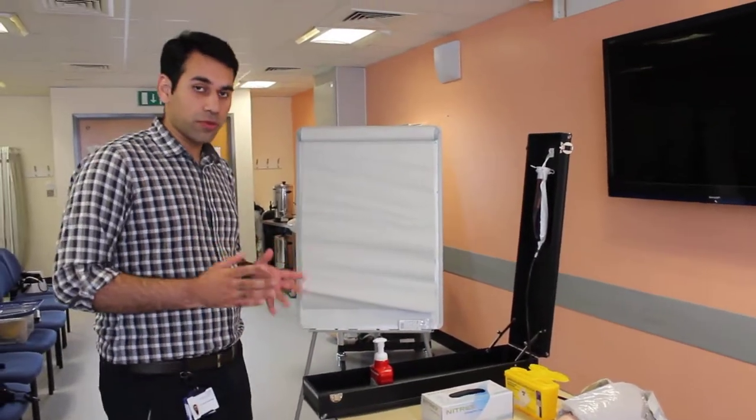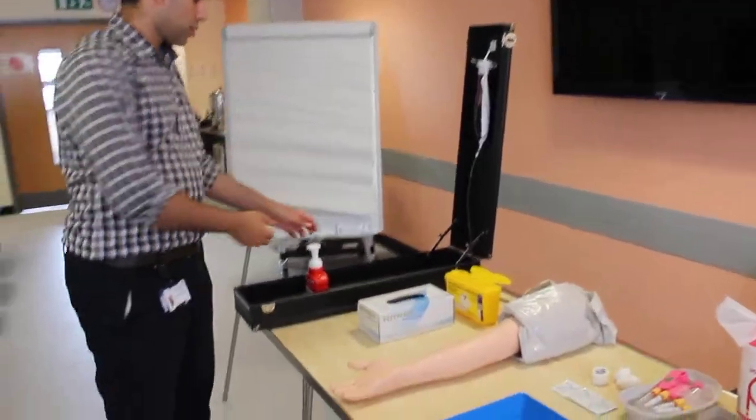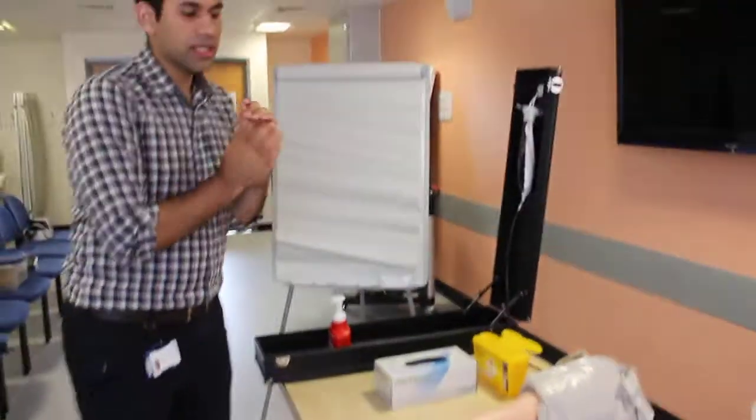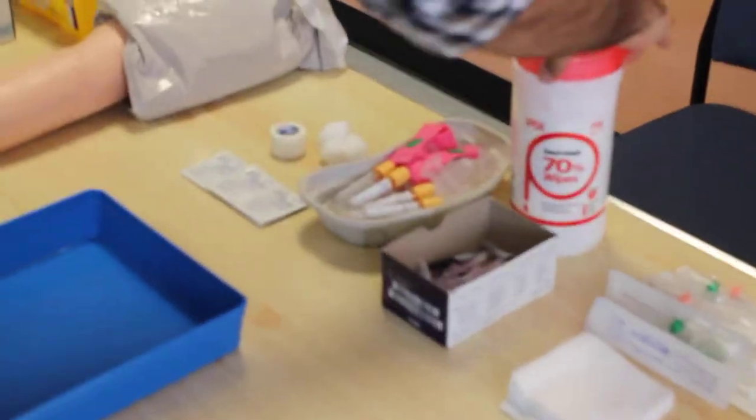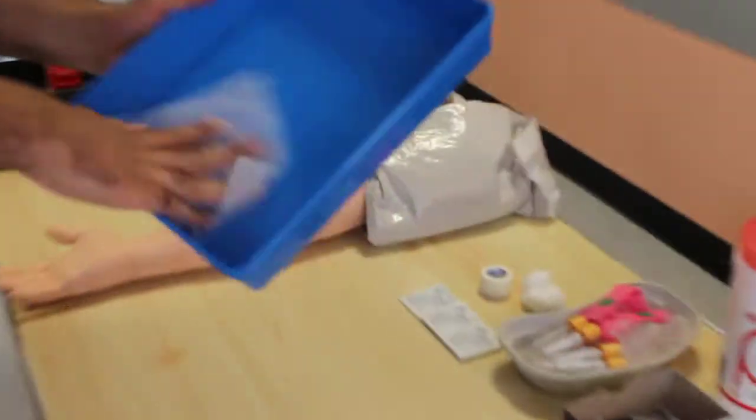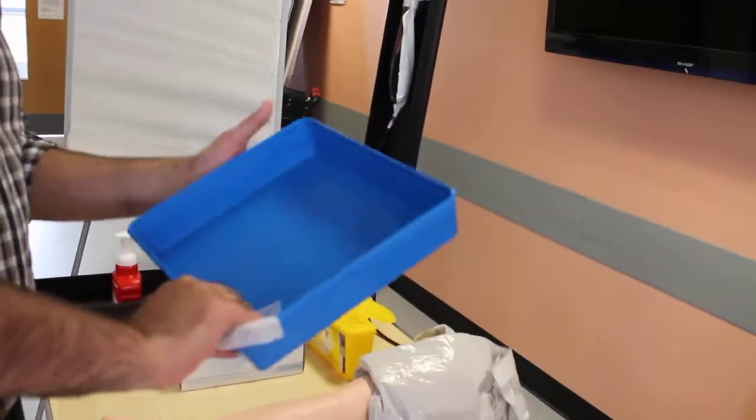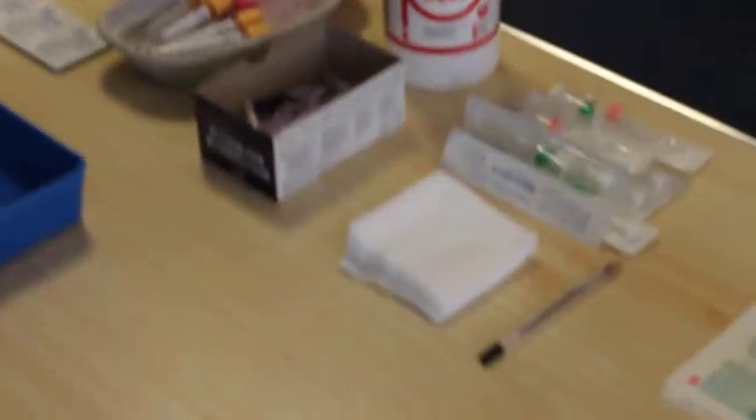I'm going to perform the venopuncture now. Go to the patient, clean your hands, prepare your clean area and clean tray by taking some wipes. Clean the tray properly, go in the crevices to make sure it's properly cleaned, and throw this away in the clinical waste bin.